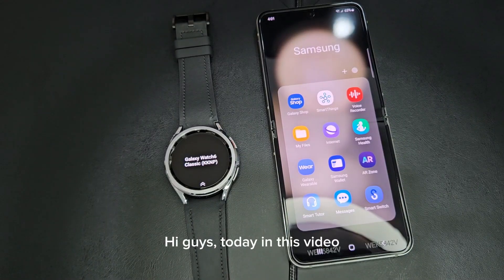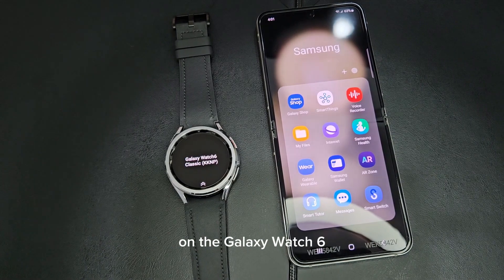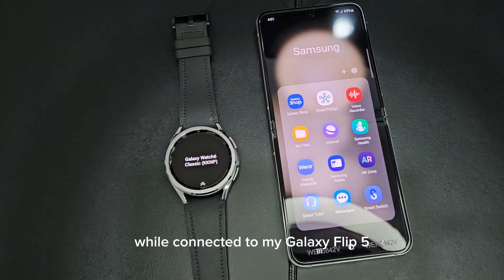Hi guys, so today in this video I'll be showing you how to use the ECG feature on the Galaxy Watch 6 while connected to my Galaxy Flip 5.